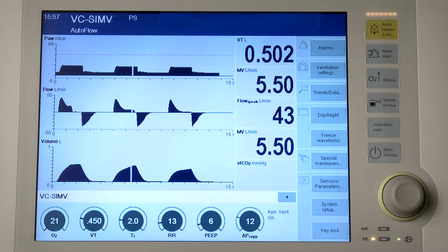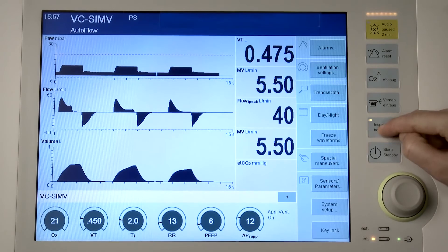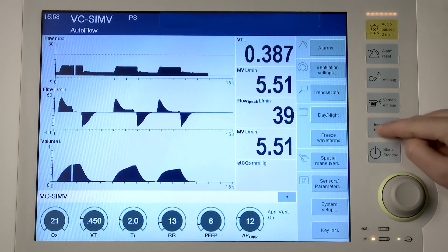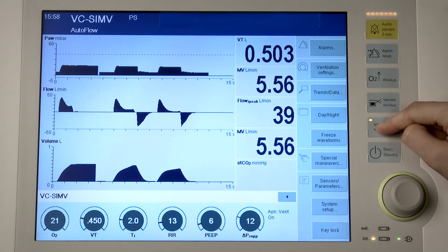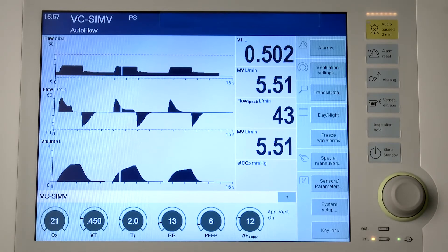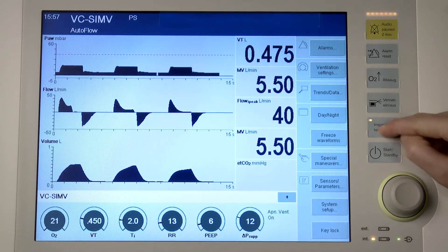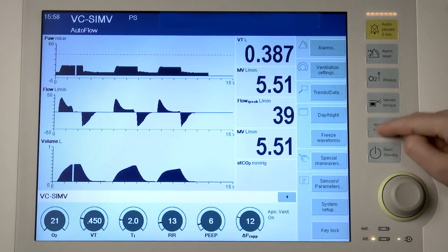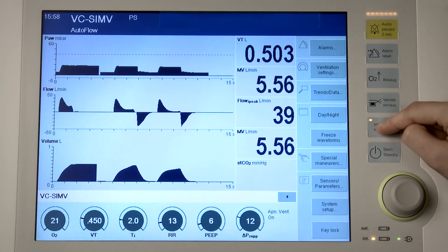The inspiration hold maneuver can be activated in all ventilation modes. Between two automatically delivered breaths, a breath can be manually started and held, or regardless of the start time, an automatically delivered breath can be prolonged. To trigger manual inspiration, briefly press the Inspiration hold key. To extend manual inspiration, press the Inspiration hold key and hold for the desired inspiratory time.